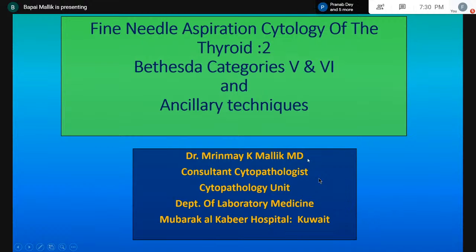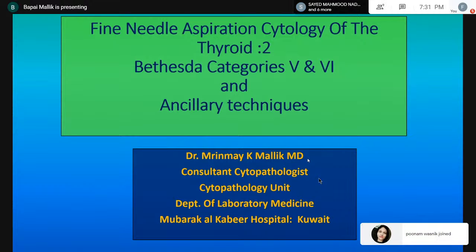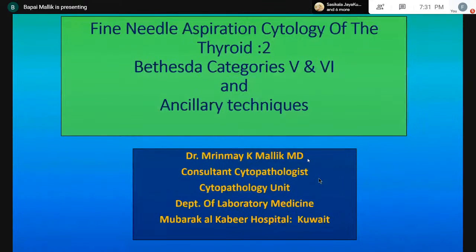Okay. That's right. Thank you, Nadeem, as usual, and good evening, everybody. Today I'm going to be talking about the Bethesda categories 5 and 6, which means the categories that are called, in general terms, suspicious for malignancy and the malignant ones.